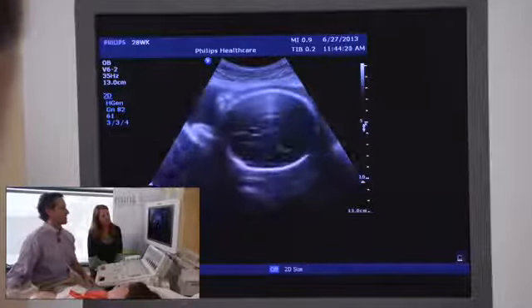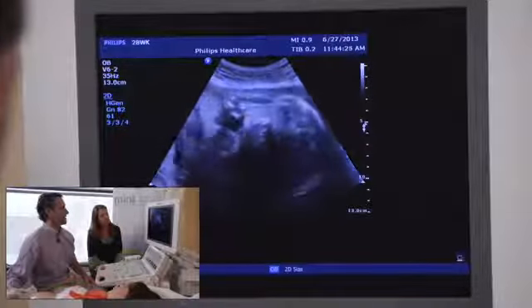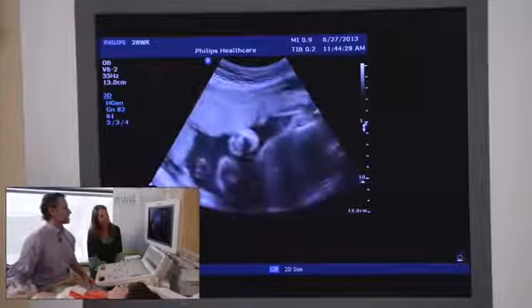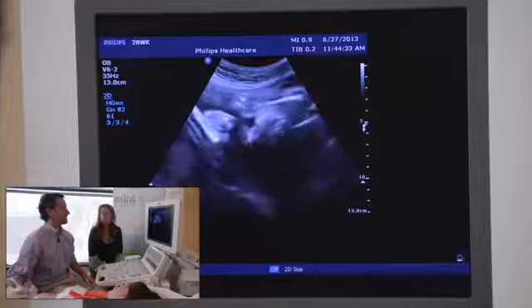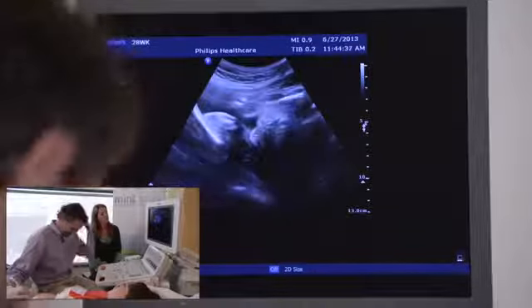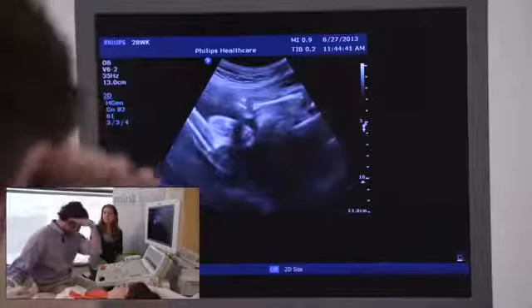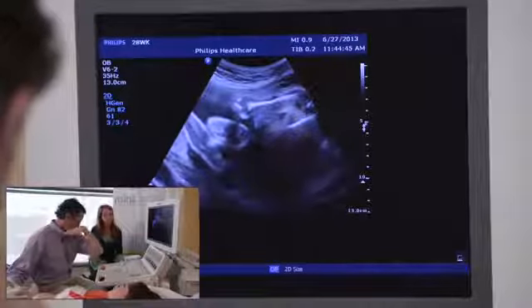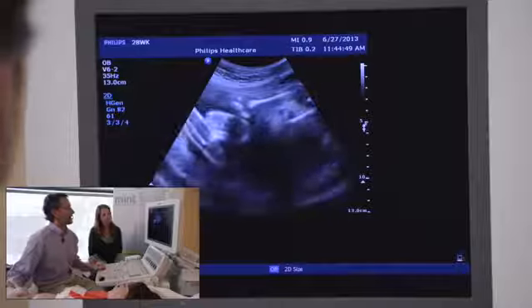As you come down from this view, we're going to immediately get into the face, and it's almost always in the exact same plane, due to the way the baby's head is positioned in the fetal position. So you're getting this angle through the head that's a little bit oblique. As you come down, you're almost getting right into the face here. And we look at the face in a coronal plane.